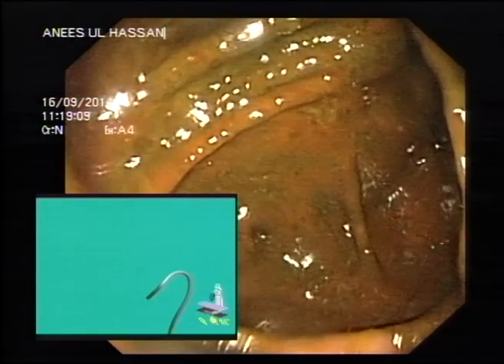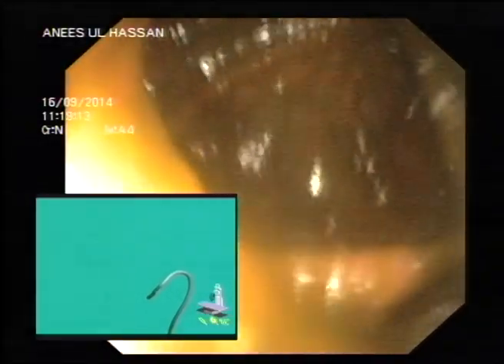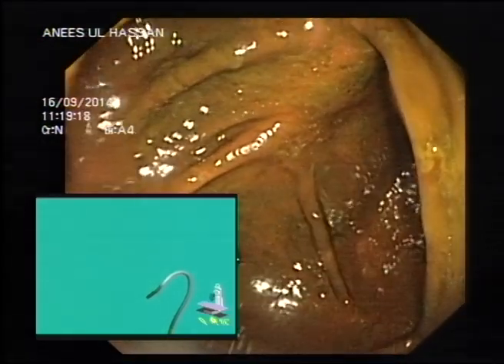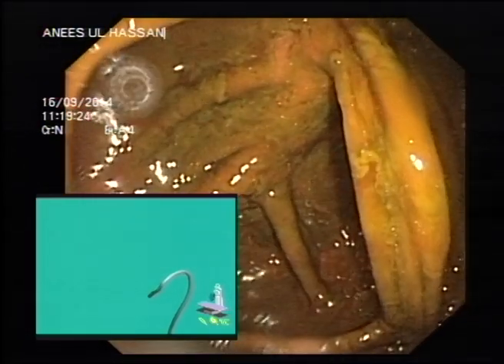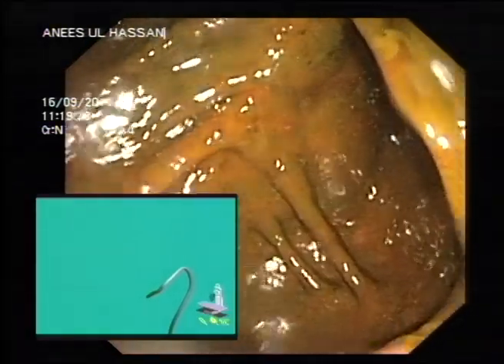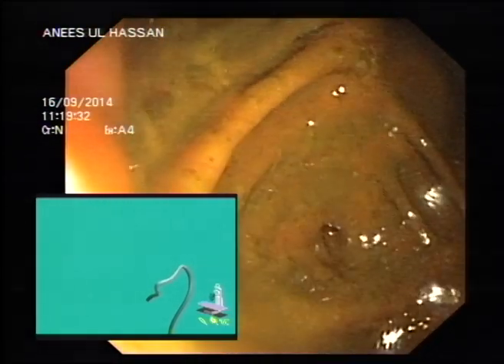I'll just get a clear view of it. Okay, it's down a bit. Pick up the one that you are comfortable with. There's more than one way of doing the same thing. That's the ileocecal valve. ठीक है, थोड़ा सा आगे कर। Yeah, there it is.